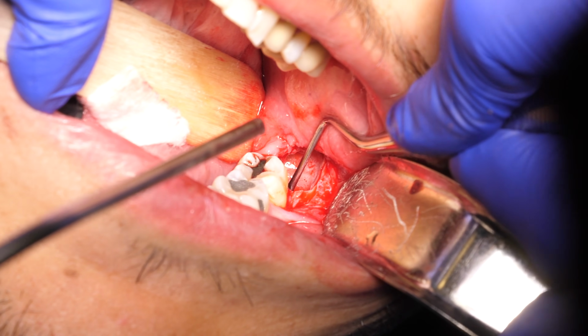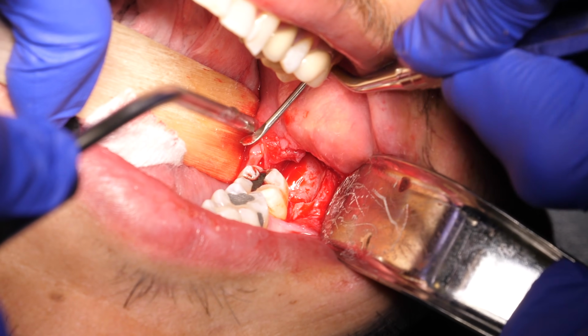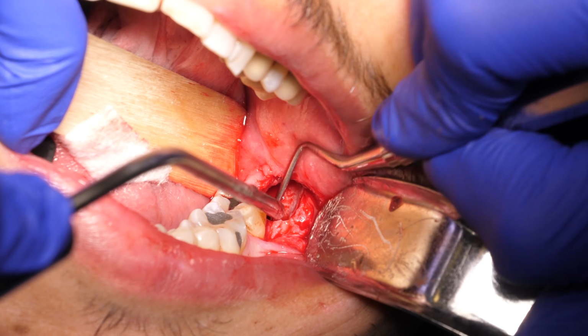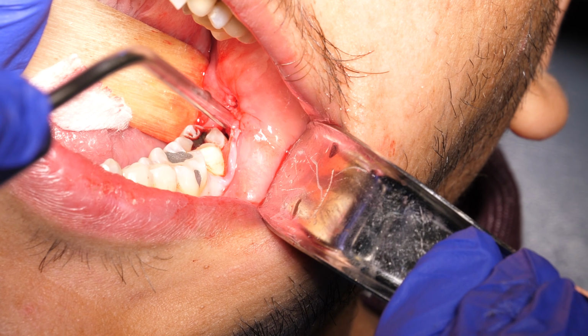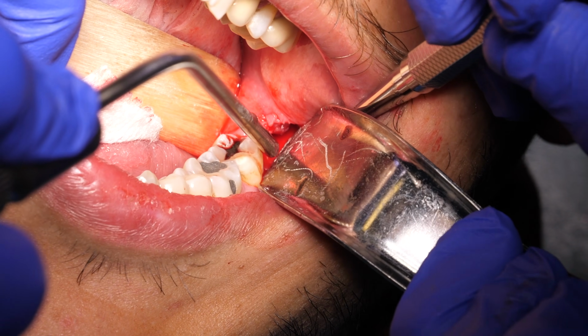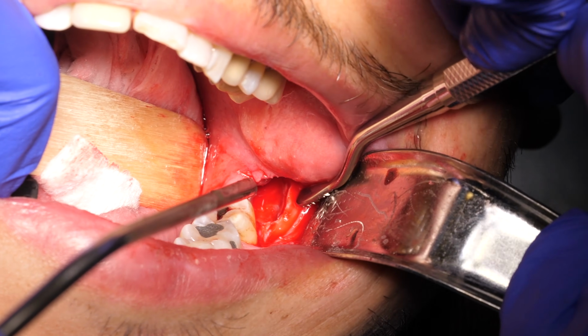In this case, the sutures are placed on the distal papilla of the second molar and on the distal buccal release incision. When suturing the distal buccal release incision, only bite the mucosal layer with your suture needle. Do not take a deep bite of the intermuscular layer. This is to prevent trismus post-operatively.